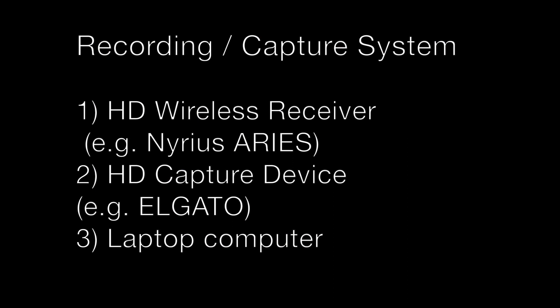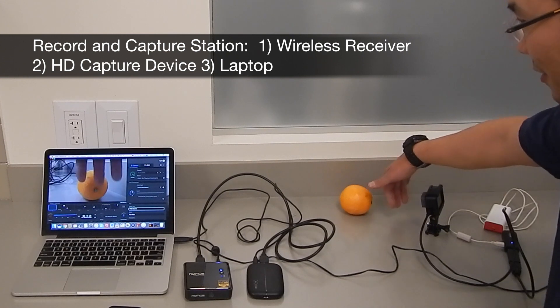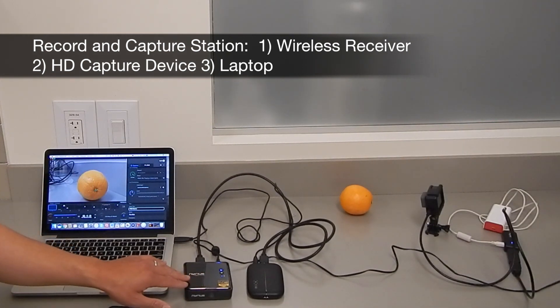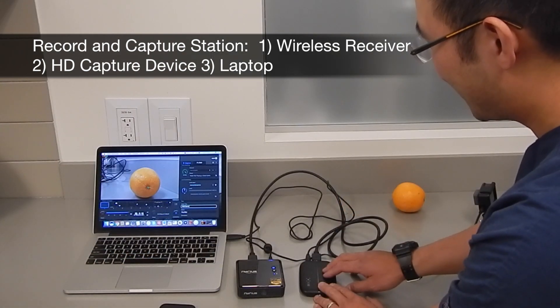Likewise, the recording and capture system comprises off-the-shelf consumer products, with some of the examples depicted here. The surgeon's kit produces a live video feed of this orange. The wireless receiver takes a signal, which is then passed to the HD capture station.